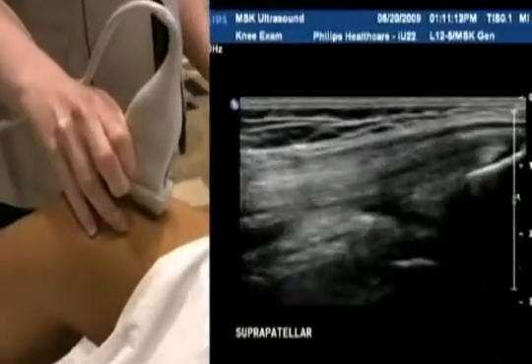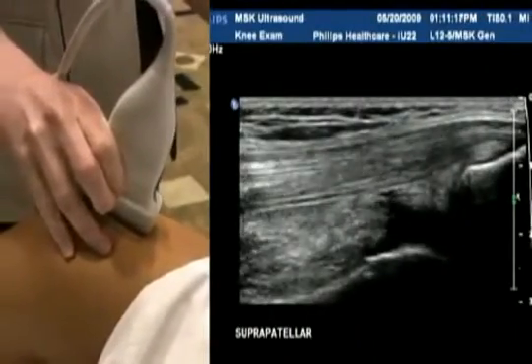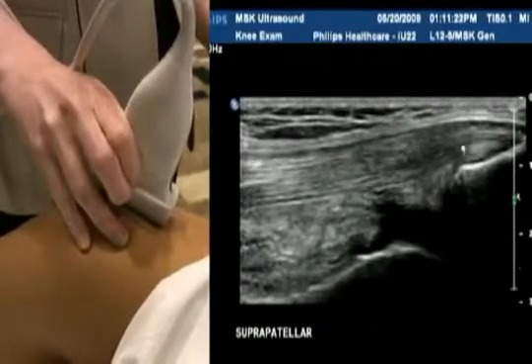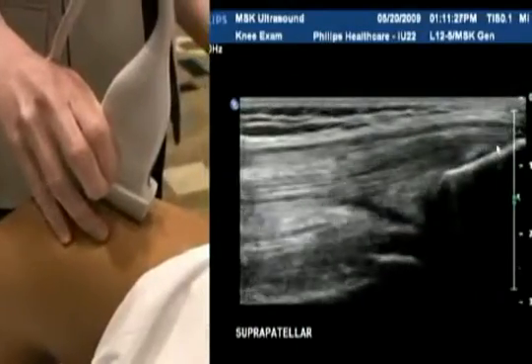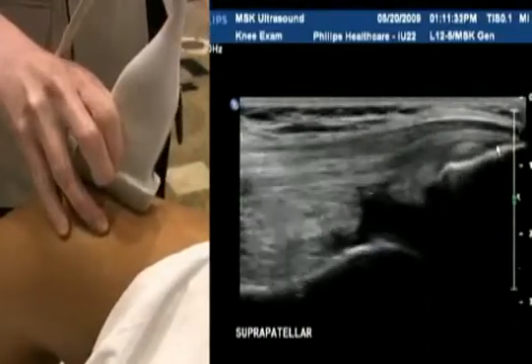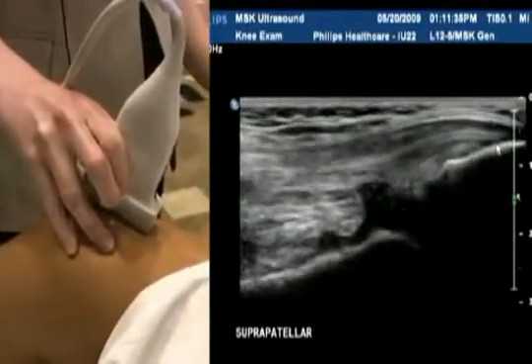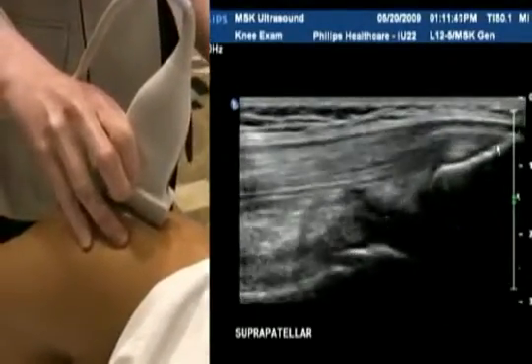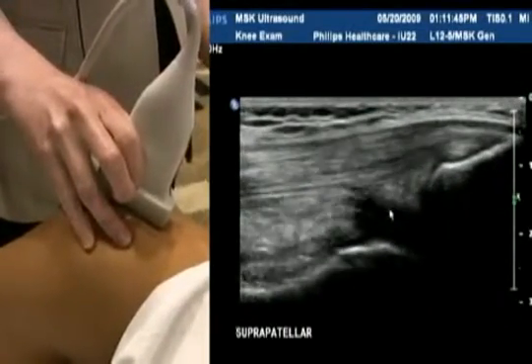I'm going to start in the suprapatellar area. You can see here the quadriceps tendon is attaching onto the patella at its superior portion. We can scan through medially to laterally, making sure we cover the entire tendon. It's quite a thick tendon, quite a wide tendon side to side. You'll see below in the suprapatellar fossa there's a small amount of fluid here, and that's quite normal.